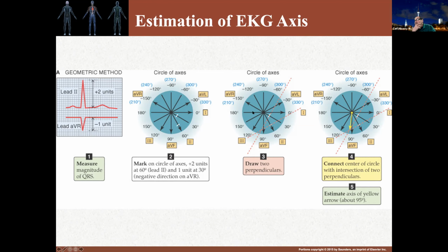And then similarly, you go to lead 2, drop a perpendicular from it, and you notice these 2 perpendiculars intersect at this point.